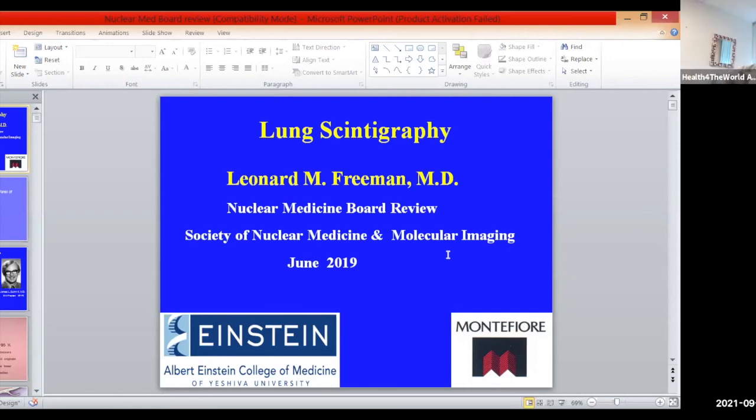Excellent. And then another question from Jerome Nobleza is, what is the role of dual energy CT in the diagnosis of PE? Well, there are different modalities as far as performing CTs are concerned, and certainly in some people's hands the dual energy might be a preferable way of doing it. The only thing I just wanted to caution you as far as CT is concerned is the concept of overdiagnosis.